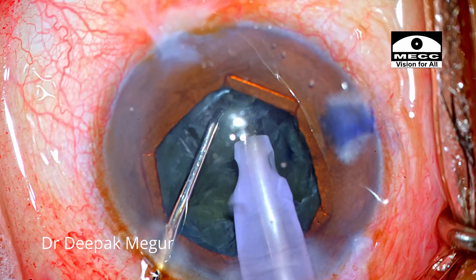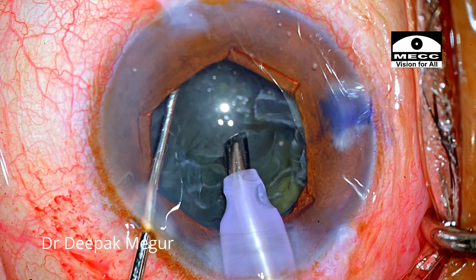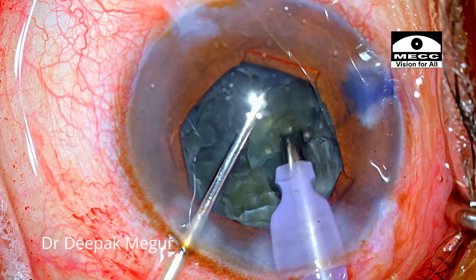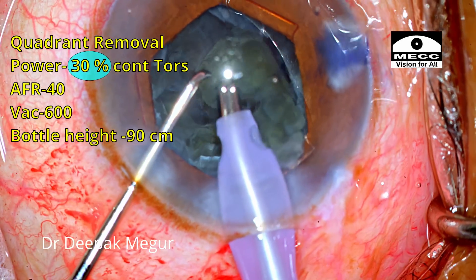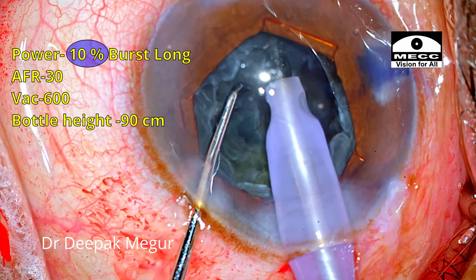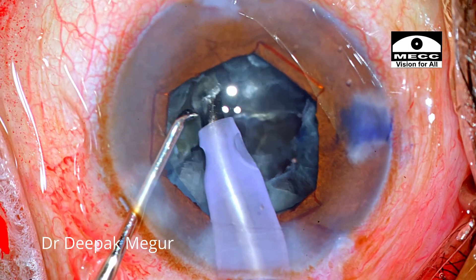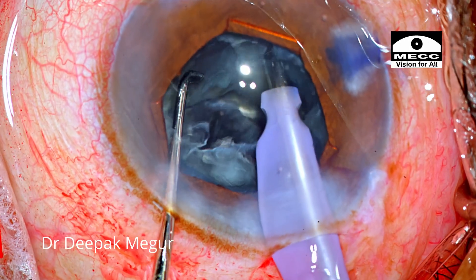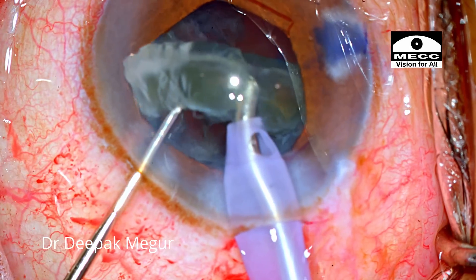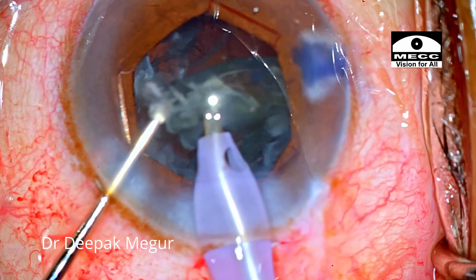I want to remove this quadrant out of the bag and quickly shift to quadrant removal mode now that we have adequate space. Pulling the fragment out of the bag is much easier using short longitudinal bursts of energy to engage the nucleus and pull it out, then emulsify it using torsional energy. I reduce to 10% energy as it's too soft — even at 10% you can't get a big purchase. But once the hemi-nucleus is out, dealing with the remaining quadrants is not an issue; we pull them out of the bag and emulsify in the pupillary plane.